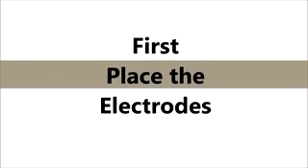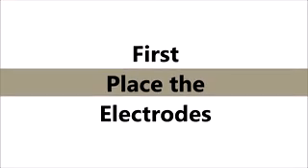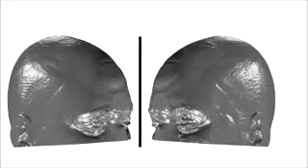Electrical brain stimulation delivers electricity to the brain by placing electrodes on the scalp and connecting them to a current source. It is important that you take proper safety precautions. The electrodes shown here were developed to maximize safety and comfort during electrical brain stimulation. These electrodes were developed by Michael Wisen and colleagues and are available through Rio Grande Neurosciences. Teams of researchers at the Air Force Research Laboratory and Wright State University use them.